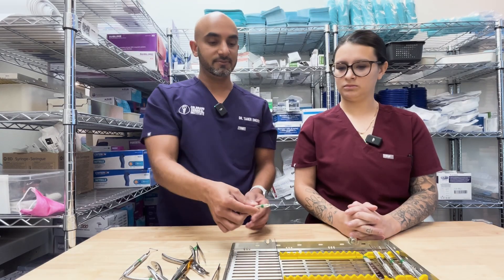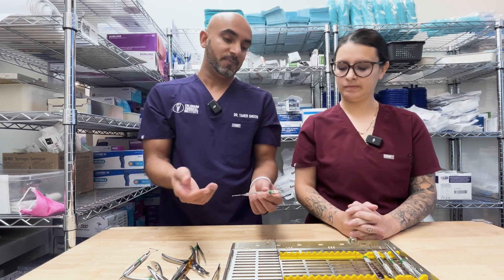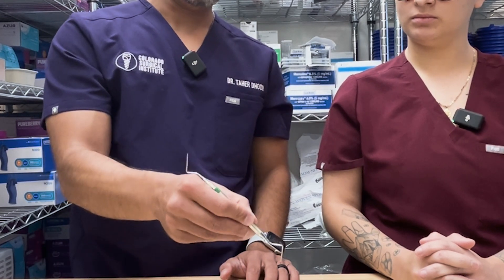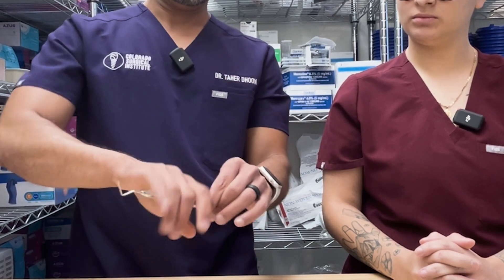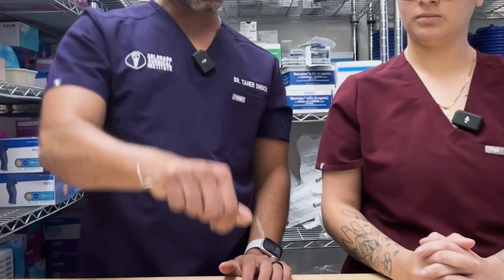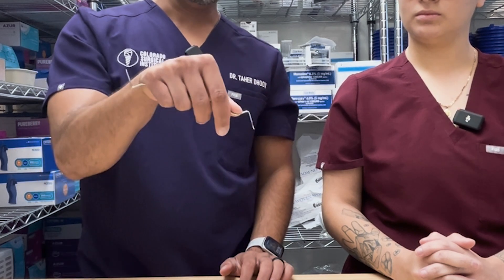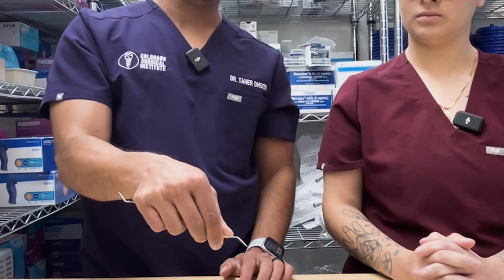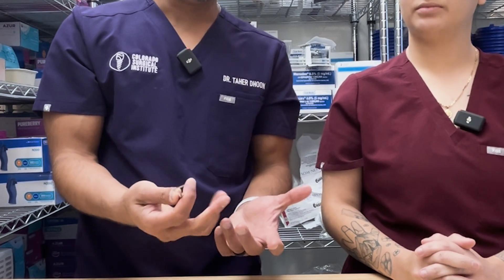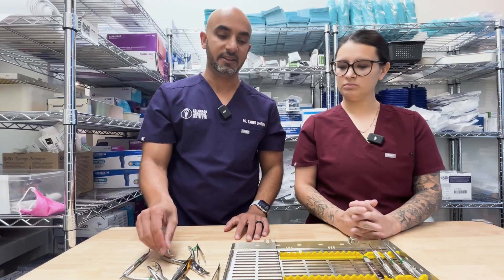Root tip picks — we don't use them that often, but you do need them every once in a while. When I was younger I'd kind of hold it loosely, but now I hold it firmly and I jam that sucker in there, cranking on it, because you've got to get that sharp tip underneath the root and pry those suckers out. Just make sure you know the anatomy for the patient so you're not pushing it into the sinus, the inferior alveolar nerve, or into the submandibular space.